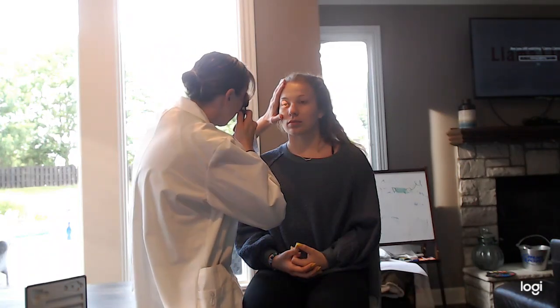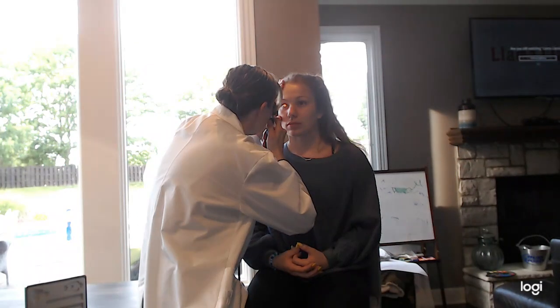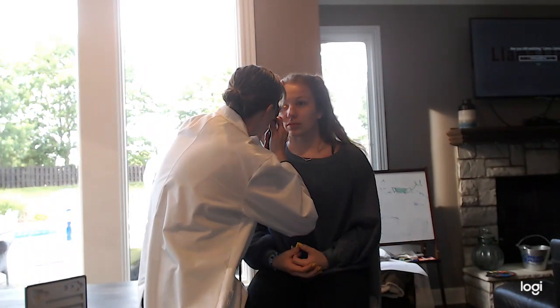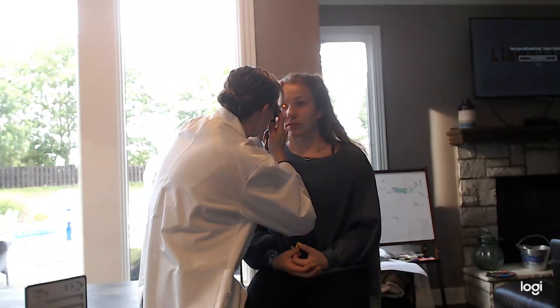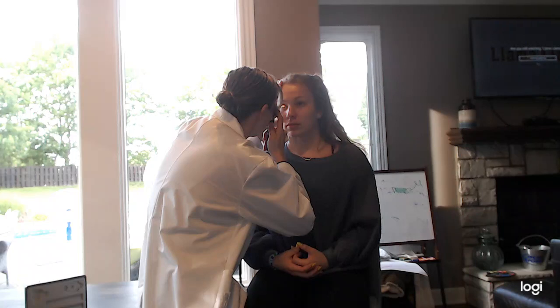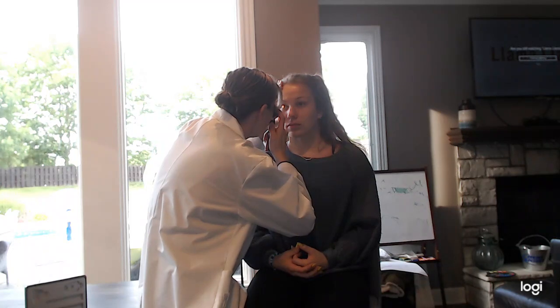I'm looking for the red reflex. Once I find that, I'm going in to look at the interior of the eye, the retina. I want to see the optic disc and the cup and make sure that it is a good ratio. I'm looking at the vessels of the eye. You want to make sure there's no hemorrhages there. And everything in that eye looks good.